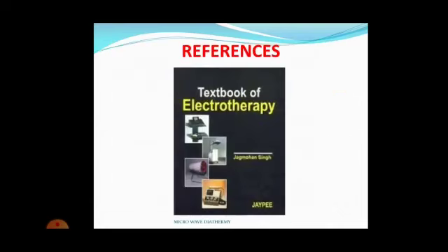Now before we complete this lecture, you will see that the use of microwave diathermy is limited in different clinical settings. That is because of the cost of this machine. Clear? As compared to shortwave diathermy, microwave diathermy costs 8 to 10 times more. So most clinical settings are not purchasing this, because we have to see budget or funding also. So you will see this very rarely, but if you have microwave diathermy at your clinic, it gives very good results.